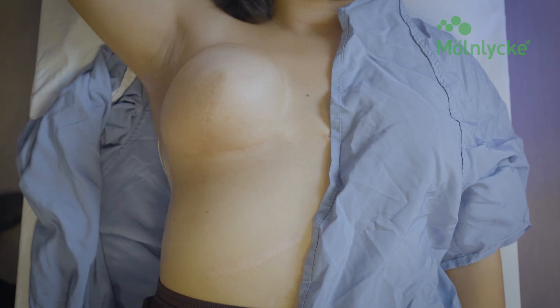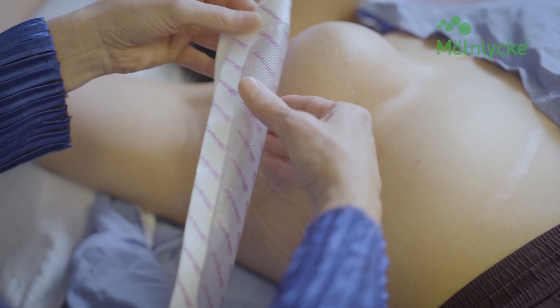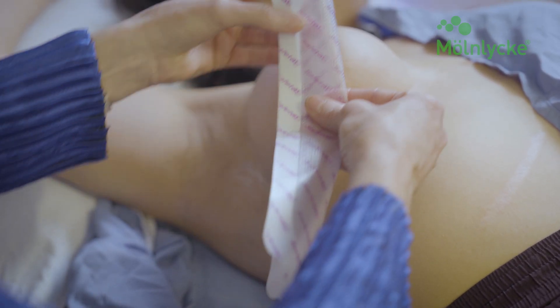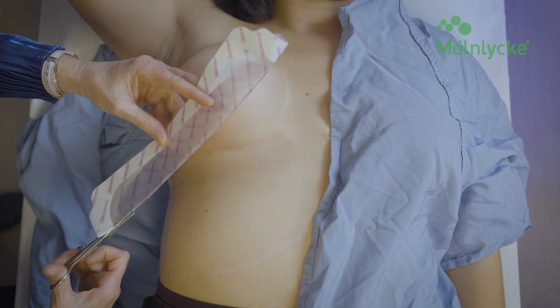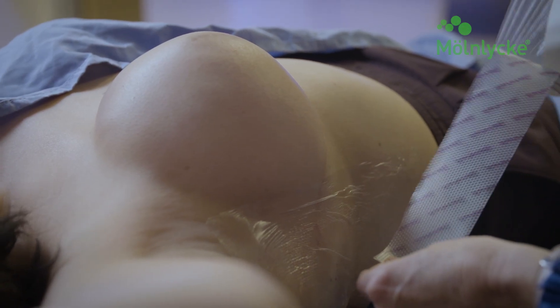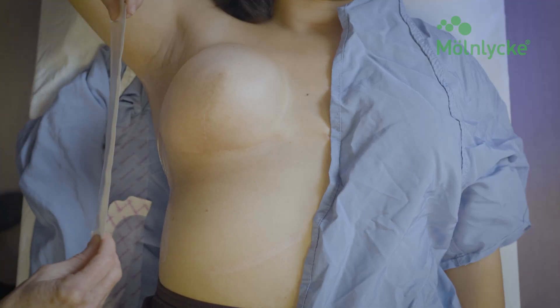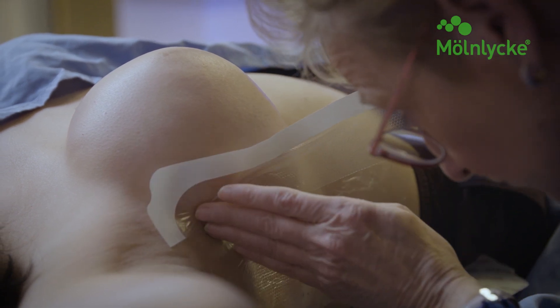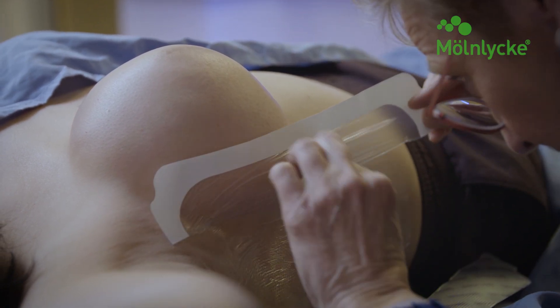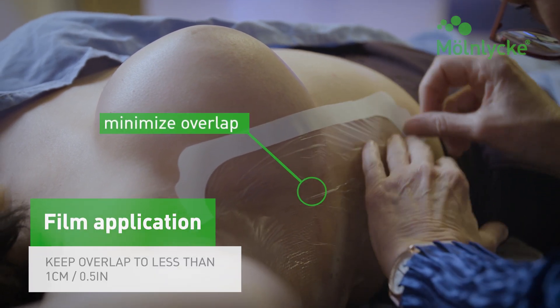Continue applying more film to cover the breast treatment area. Take another 10 x 25 cm sheet and cut it in half lengthwise, creating a 5 cm strip. Remove the paper backing from the strip and place the strip where the breast begins, ensuring it lands underneath the inframammary fold and onto the upper abdomen, with less than 1 cm overlap of the dressing edges.